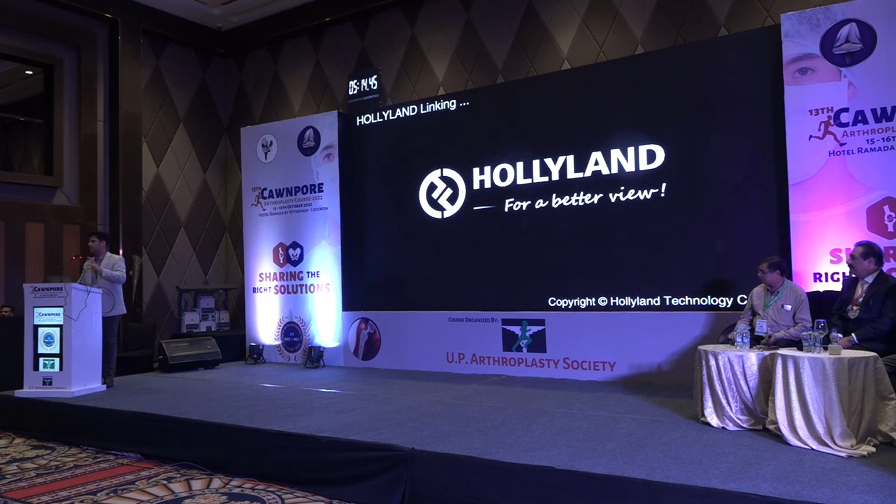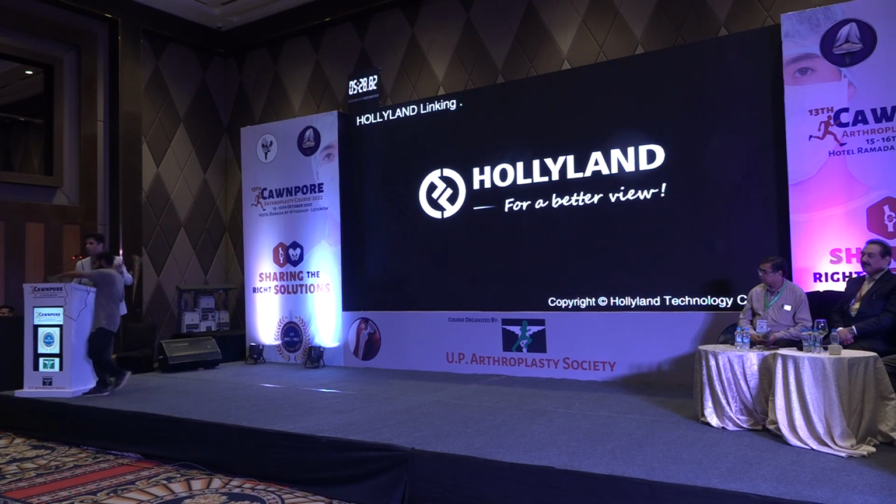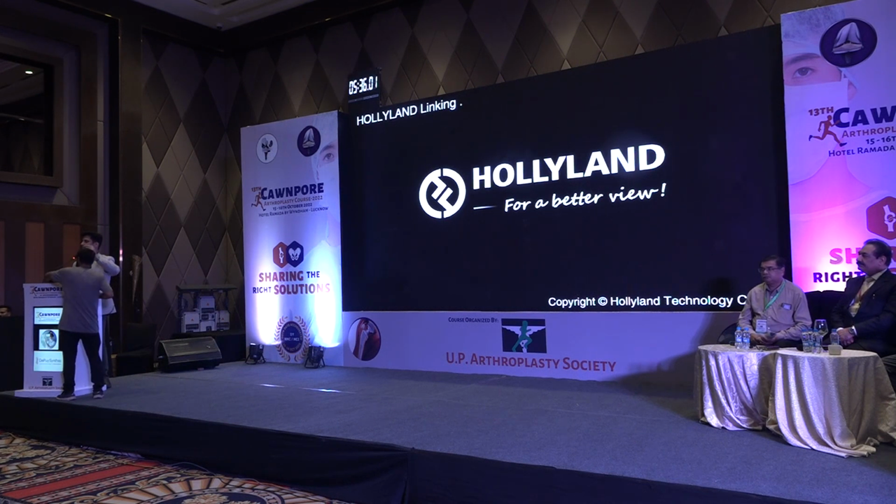But in essence, the cement removal is tougher than the cemented stem removal. Keep this in mind. So there may be times when you don't want to remove that cement. There may be times when you want to remove the cement. If you want to remove the cement, there are two ways to do it. You can go from the top, what we call the antegrade method, where you gradually chip away at the cement, gradually release, gradually use thin flexible osteotomes, wires, small burrs to remove the cement piece by piece by piece and try not to damage the proximal femur. That's one way to do it.